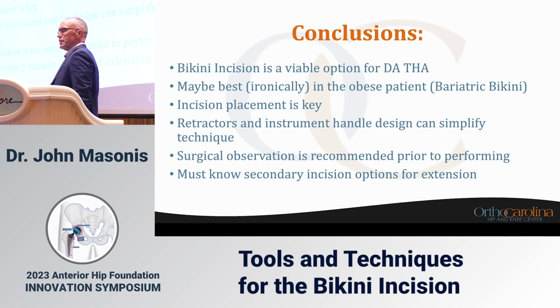So incision placement is really the key. Retractors and instrument handles can simplify the technique. Surgical observation is recommended prior to performing, and you just must know the secondary incision options for extension. There's nothing worse than being in a surgery, having a complication or something happen unexpected and not having the ability or the knowledge to be able to address it in the same surgery.